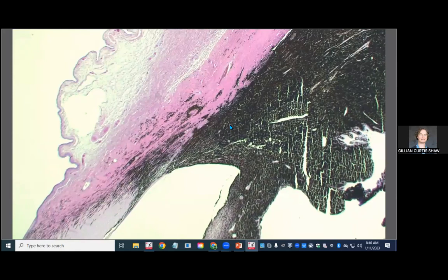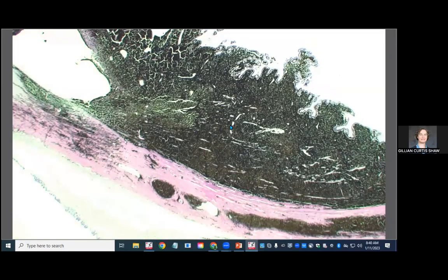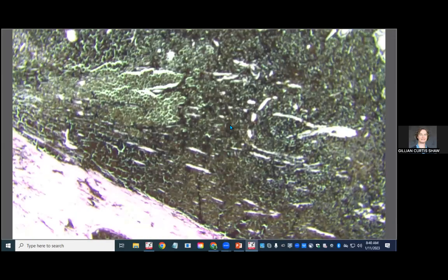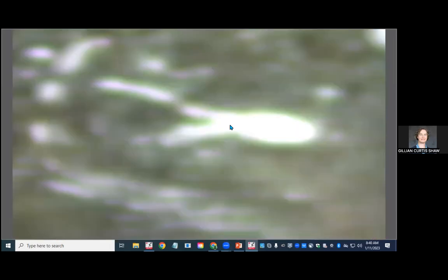To decide whether we're looking at a tumor or melanosis, first of all, we ask ourselves whether there's an actual mass. And in this case, there's this diffuse expansion of the uveal tract by these cells. So we don't really necessarily have a discrete, well-defined mass. The other question we ask ourselves is what is the morphology of the involved cells? So let's take a higher mag look.